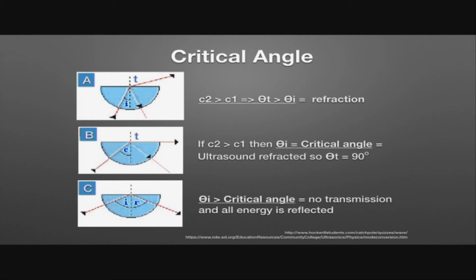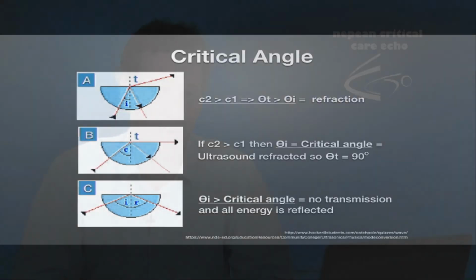If your incident angle is greater than that critical angle, we are going to get no energy transmitted at all, and 100% of the energy will be reflected.